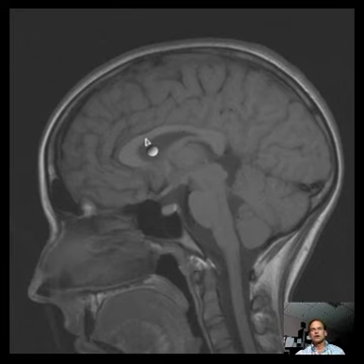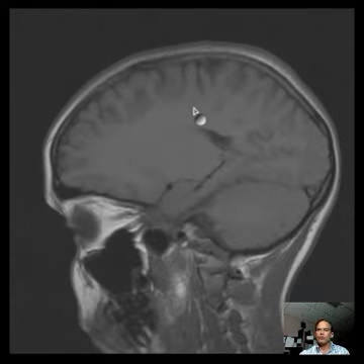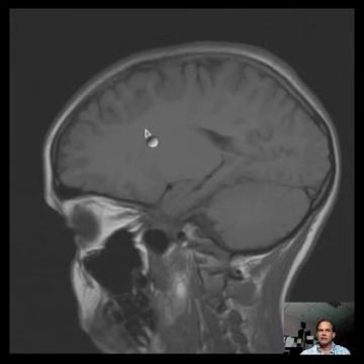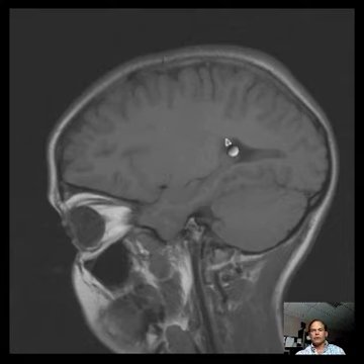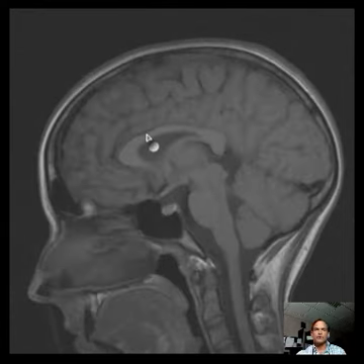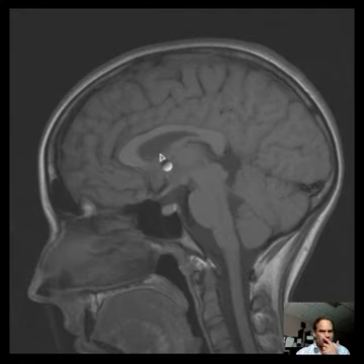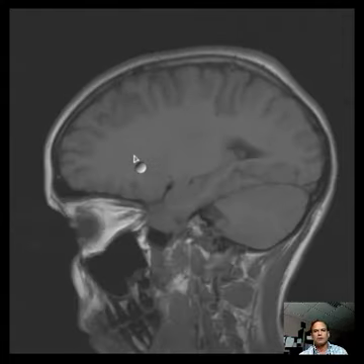Notice how different the corpus callosum looks compared to the brain substance around it. As you go out to the side, you see how it blends imperceptibly with the white matter. The cortex is grayish in color and the white matter is actually white. All of this subcortical white matter courses to various locations, with a large part going from one hemisphere to the other — you can see the convergence in the corpus callosum. This is where millions of compacted fiber tracts course from one hemisphere to another.